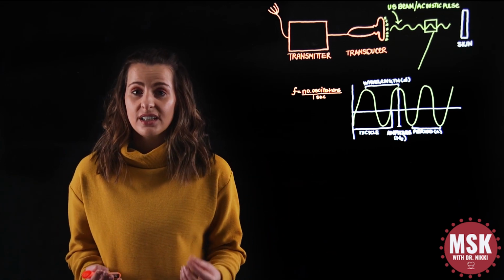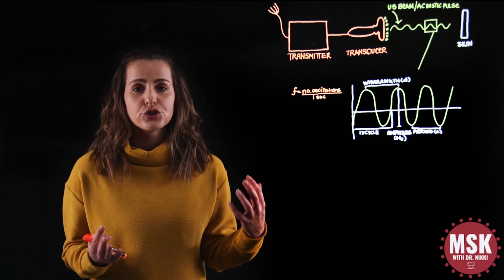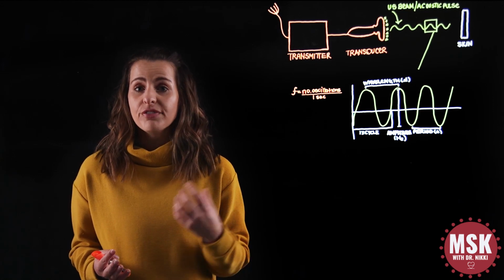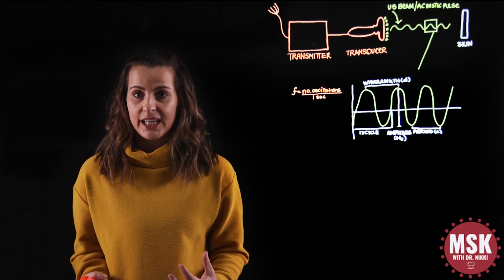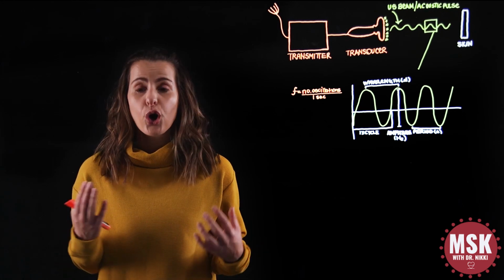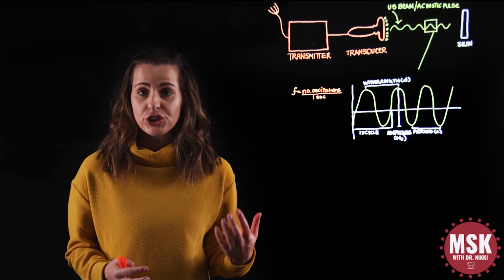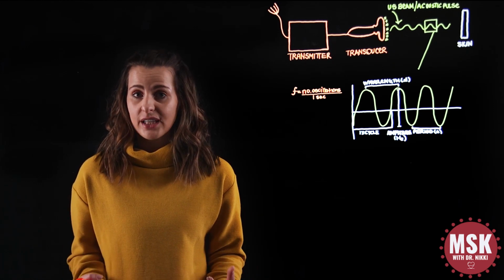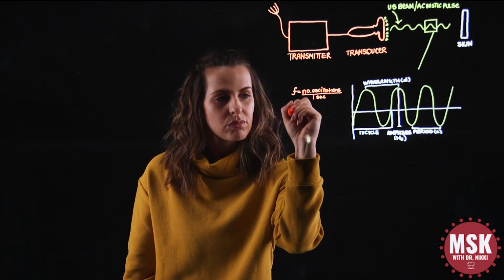Lastly, we need to consider the velocity or the speed of sound. When a sound wave travels through its medium, it is certain parameters of that medium or material which determine the speed of sound propagation. These factors are going to be the density and the compressibility of the material. So we can calculate propagation velocity as frequency multiplied by wavelength, and this is represented in meters per second.